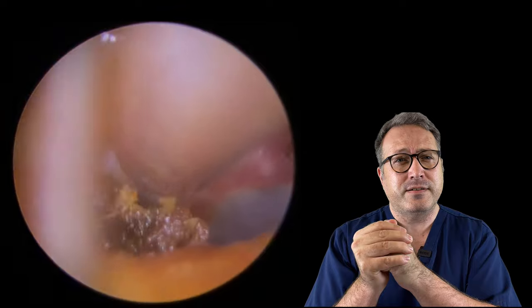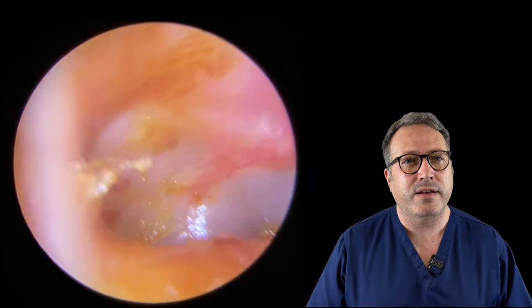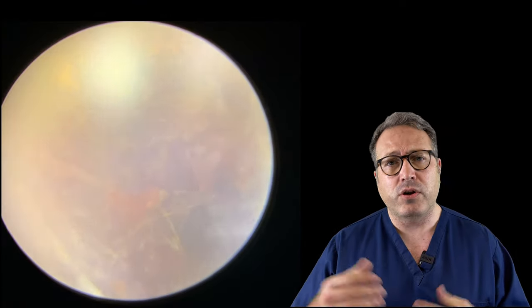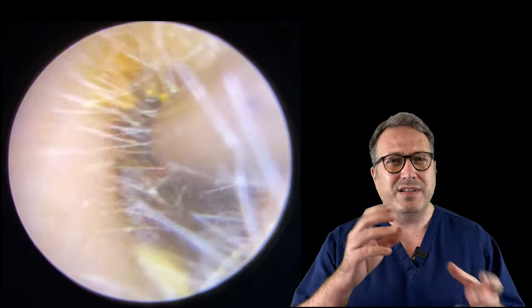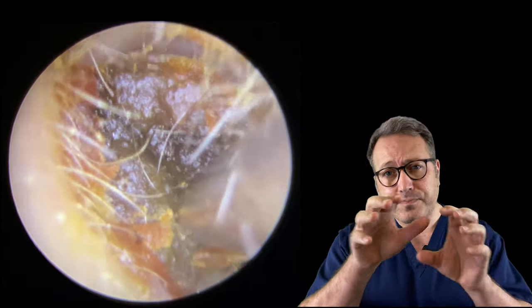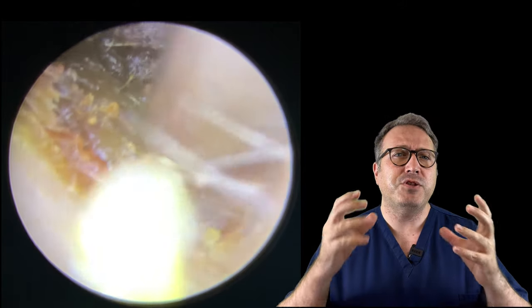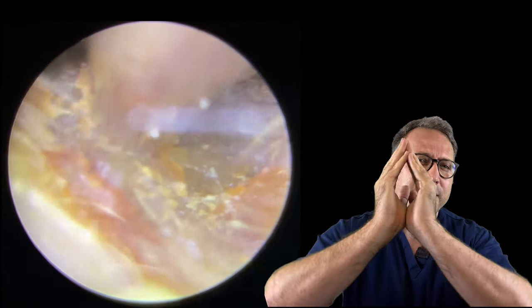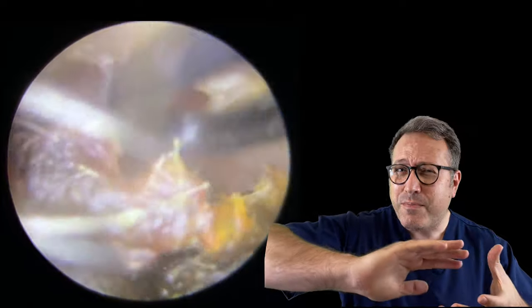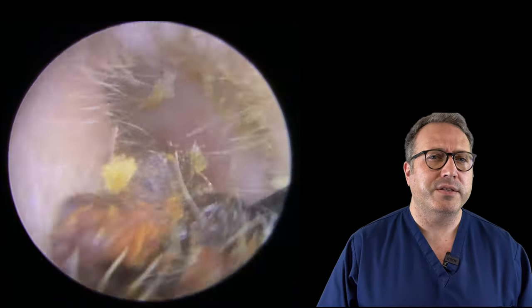I'm keeping to the larger suction tube - normally I'd swap to the fine end at this point, but because it's so thick and hardened up in there, the fine end's not going to cut it. We're going to have to use the standard size. There we go - look at how much of that lifted out. We're going to bring that last little bit of wax away - you can see a little bit of dry skin come away as well on that left hand canal wall. Fair play, the patient was an absolute trooper - they did so well to get through that. Not an easy extraction to sit through. Now on the other side, you can see a little gap just at the top of the wax there - that's why the hearing's been intermittent. As the patient's been chewing or yawning, jaw movement causes the outer canal to flex, and that gap has been closing and opening. We're going in with the Jobson horn here, over the top of wax, just folding it all forwards - there we are, you can see this just coming away really nicely.